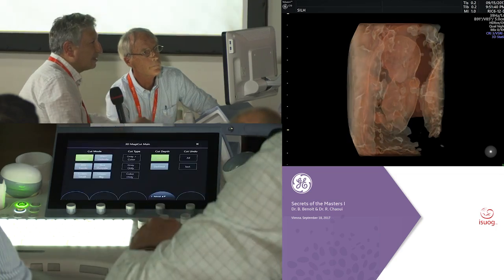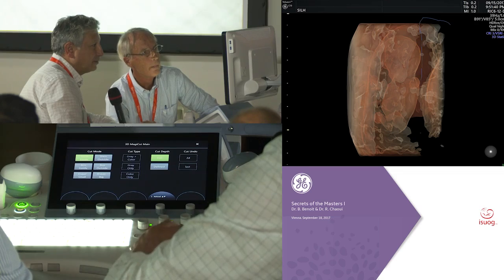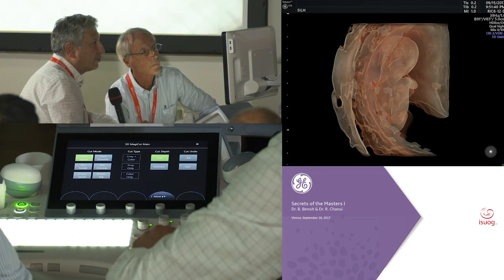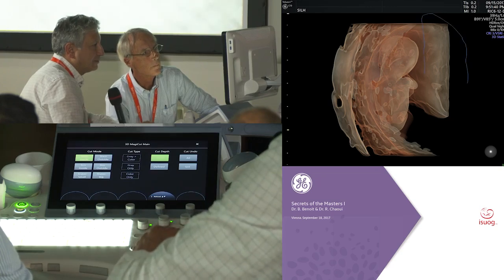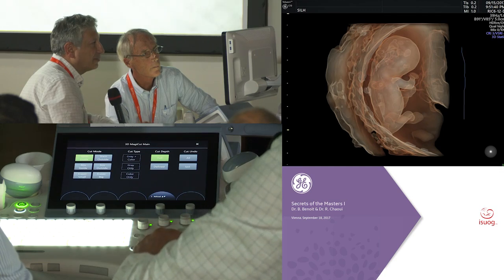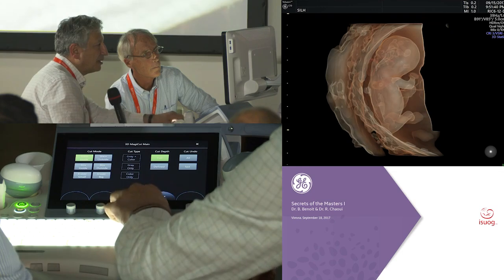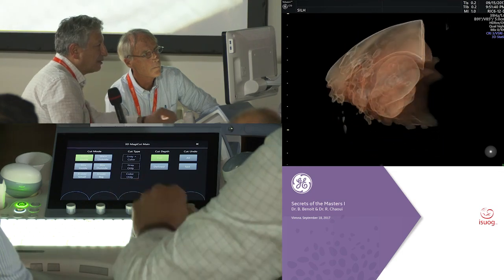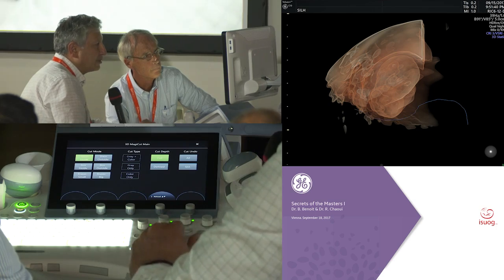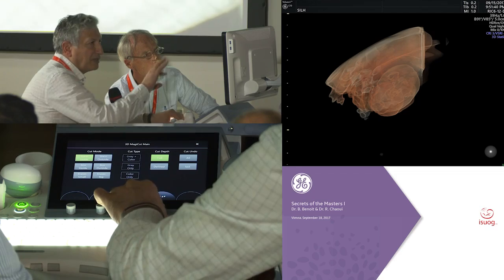So I just start removing part 1, like this. Turn, remove part 2. Remove part 3. Because I see exactly where are the structures disturbing me. And here, everything is well recognizable. And the patient has not seen anything.